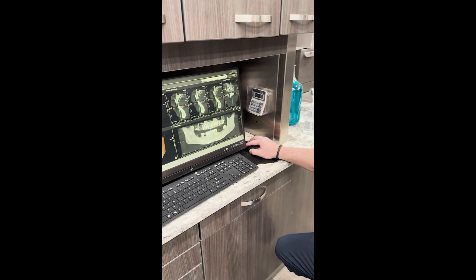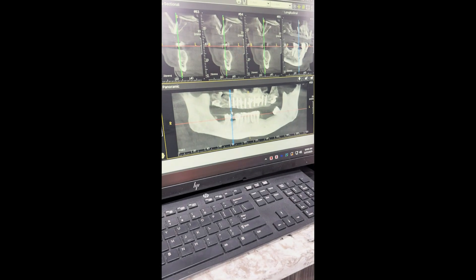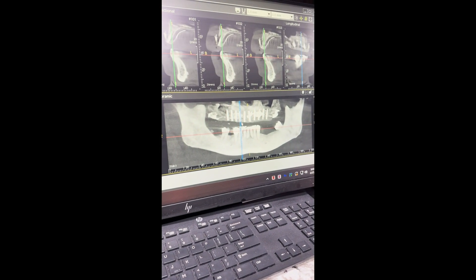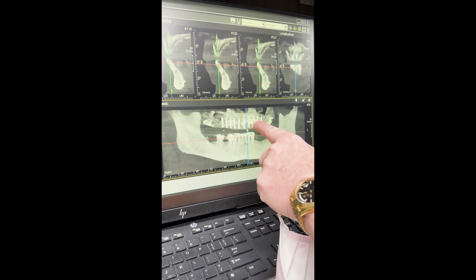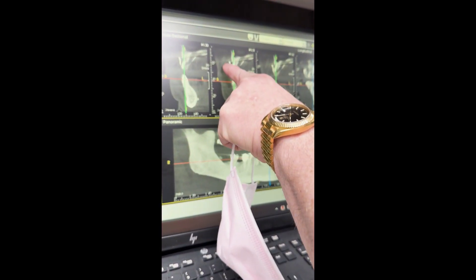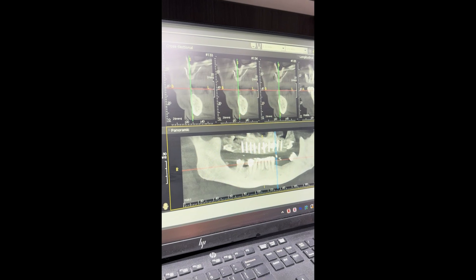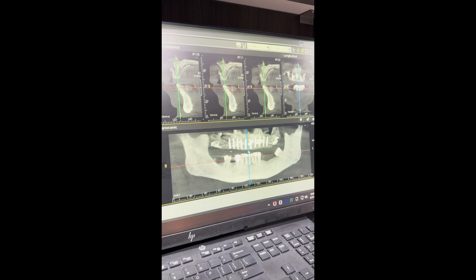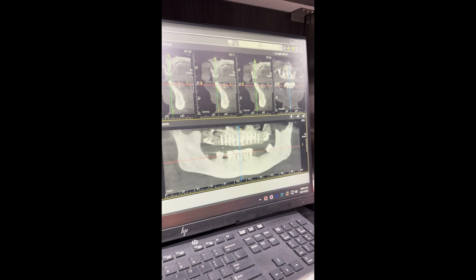Here's the post-operative x-ray with the 10 implants in place — looks really, really good. Everything looks great. This artifact you're seeing is the reline in the denture, nothing in the bone — just the reline material showing on the denture. There we are with the 10 implants looking great — all those implants torqued at 30 to 60 newton centimeters of torque.